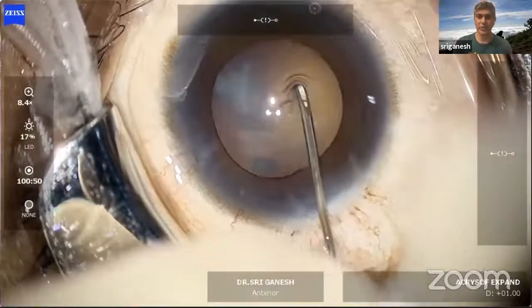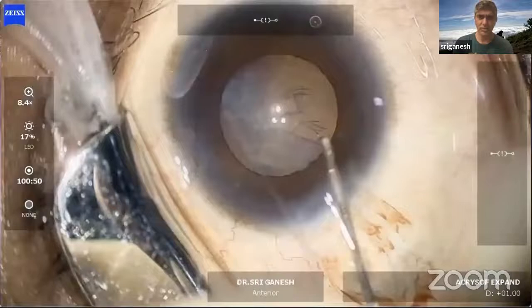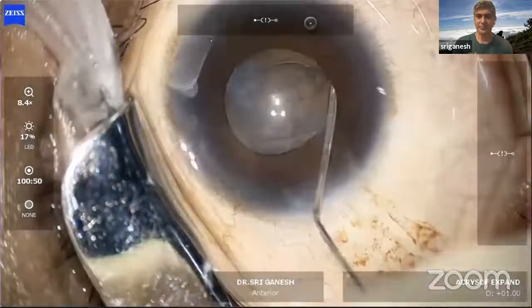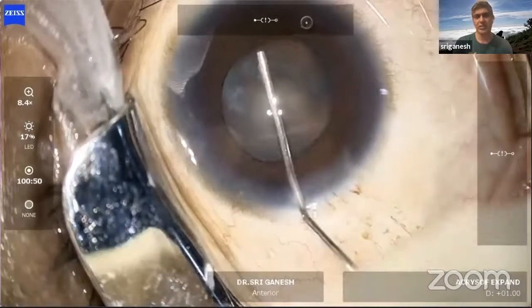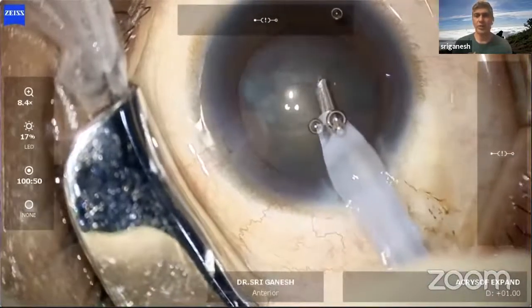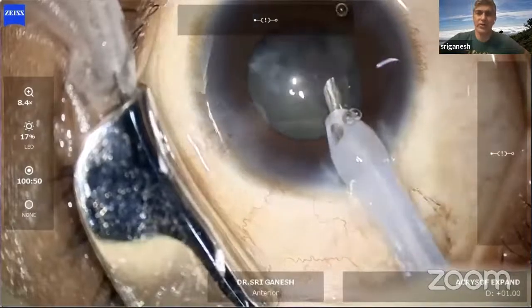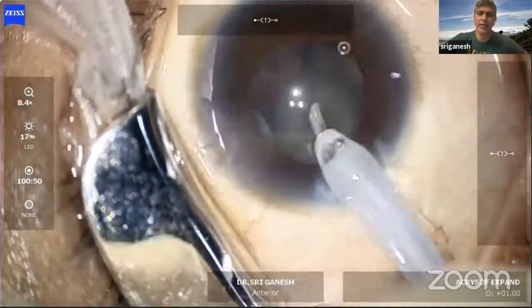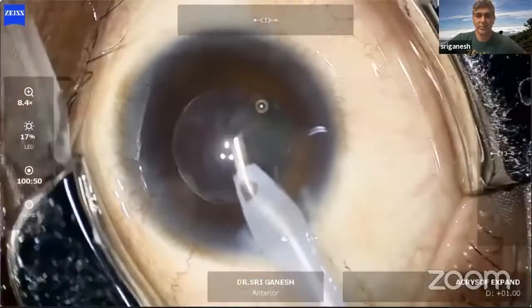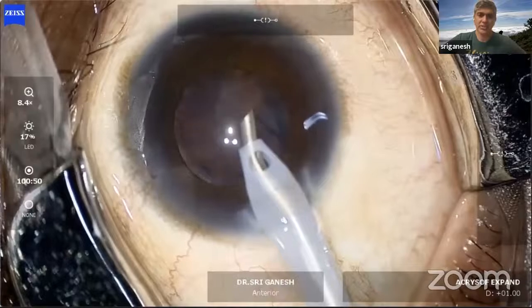And then you continue with capsulorhexis. You can see that there was a little spider sign there. That's because the zonules are weaker in these high myopic patients. Once you complete the rhexis, these soft nuclei can be prolapsed into the chamber. I'm using a Centurion. I keep the IOP at 20 because I don't want the AC to deepen suddenly, and under topical, it can be quite uncomfortable if you use a high IOP. These cataracts are quite soft. They can be evacuated mainly with just vacuum. You don't have to use much phaco energy, and the surgery itself is quite fast.